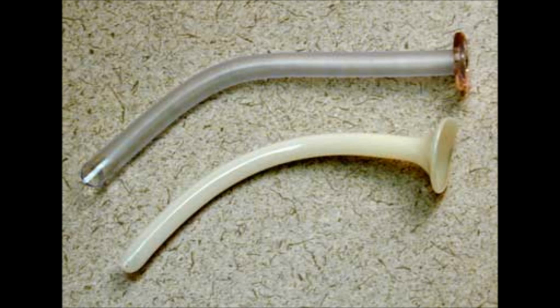This adjunct is used as an alternative to an oropharyngeal airway in patients who need basic airway management. This is what we call the nasopharyngeal airway. Other people call this a nasal trumpet. It's a soft rubber or plastic hollow tube that provides a conduit for airflow between the nares and the pharynx.